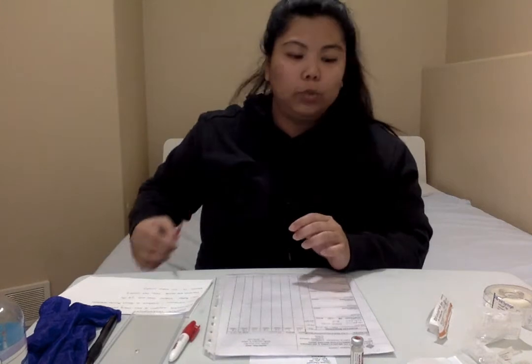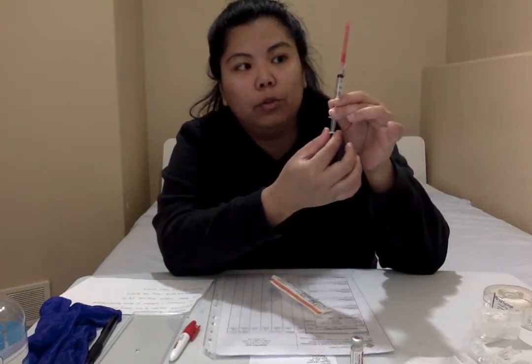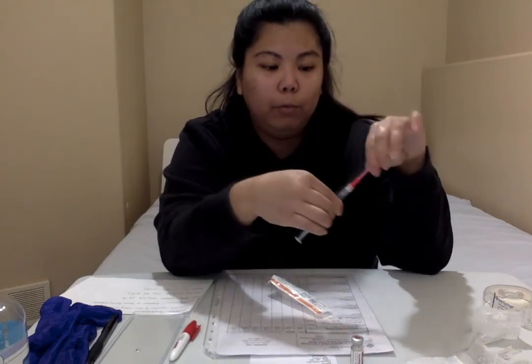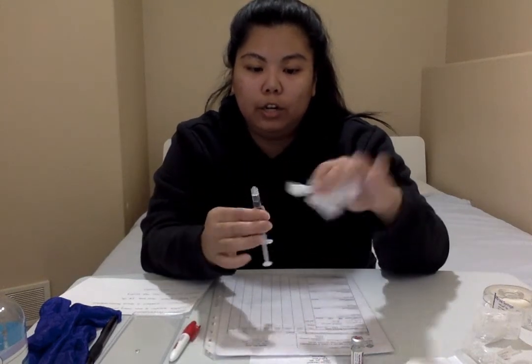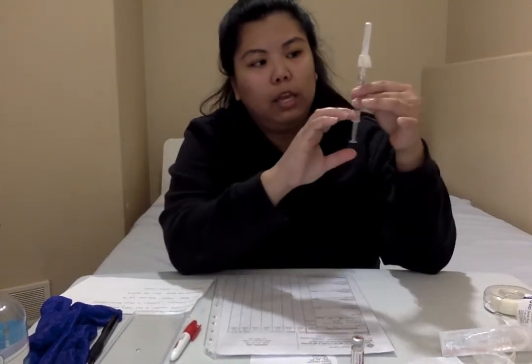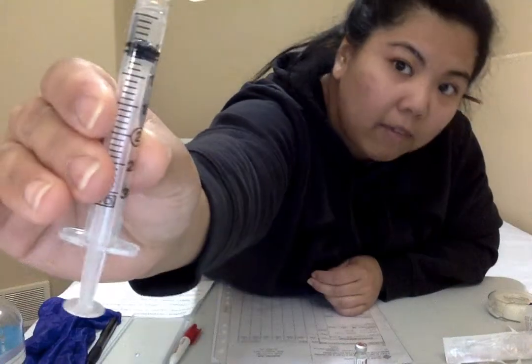And then we want to switch to our injection needle. But before we do, we want to make sure that all of the medication is within the barrel of the syringe. So to do that, we'll pull back the plunger, and then we'll remove our blunt fill needle. This will go straight into the sharps disposal container, and then we'll connect our injection needle. And then we want to recalibrate back to the correct volume of medication that we need. So 0.5 ml. Just want to show onto the camera that we have 0.5 ml.